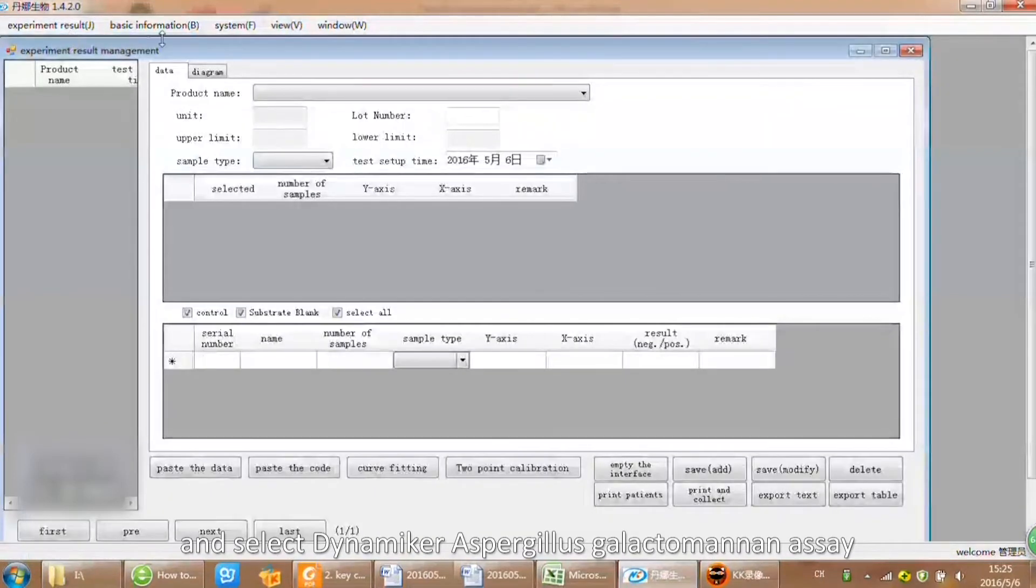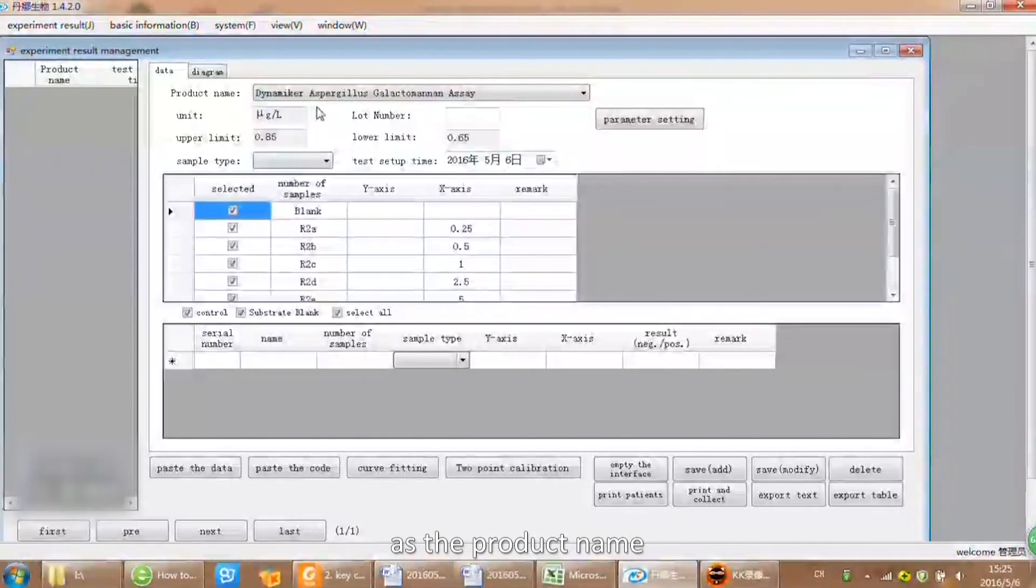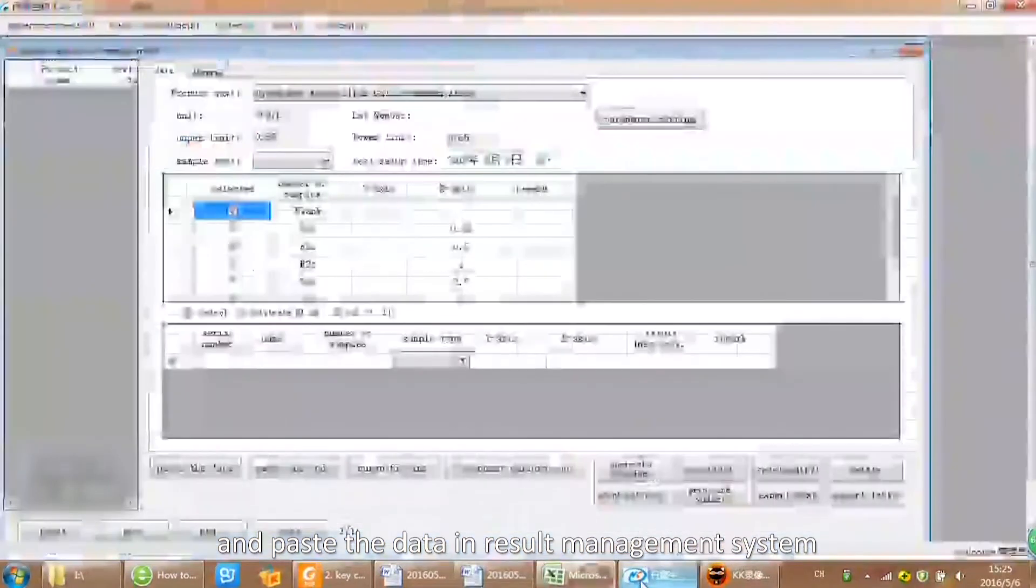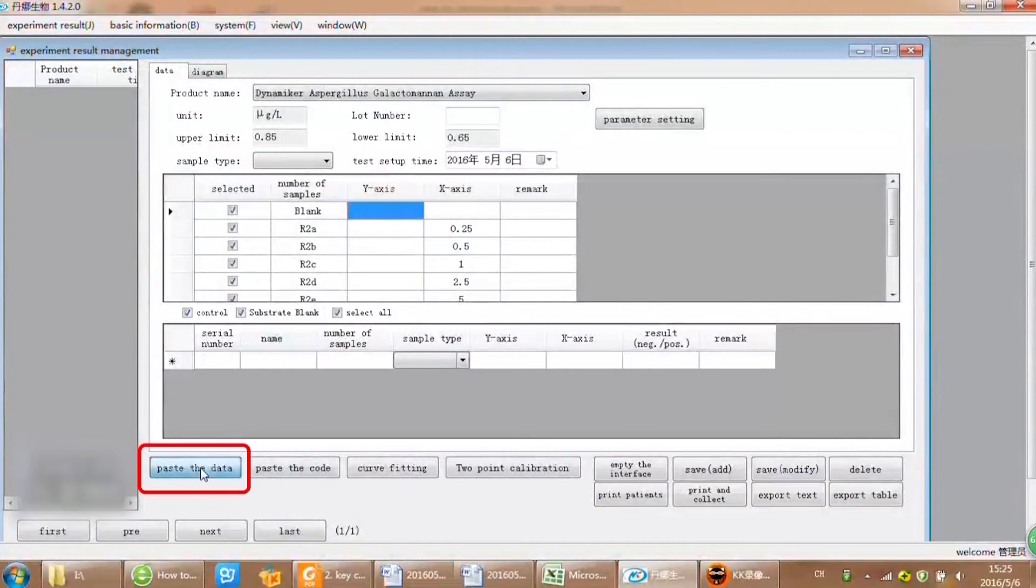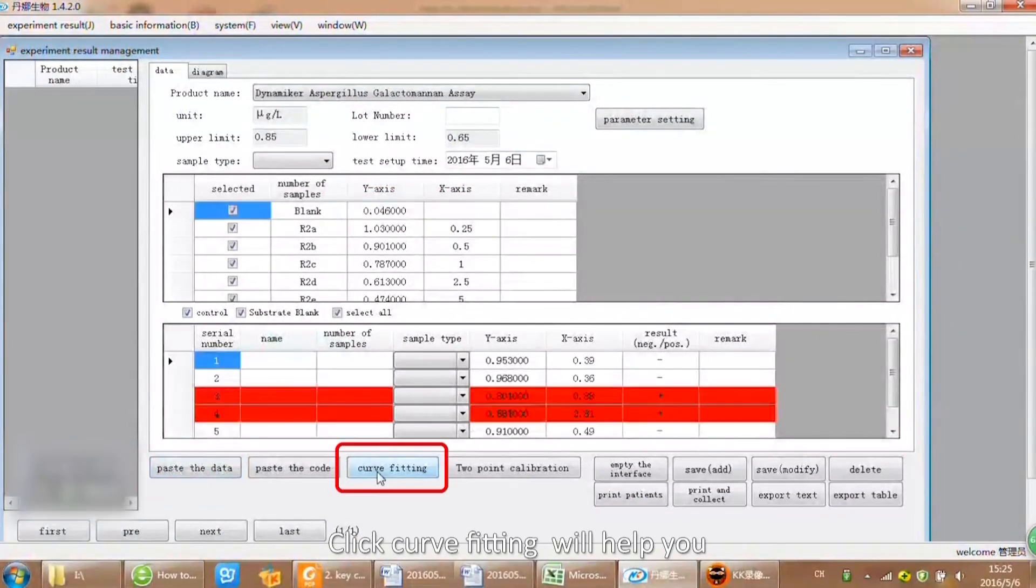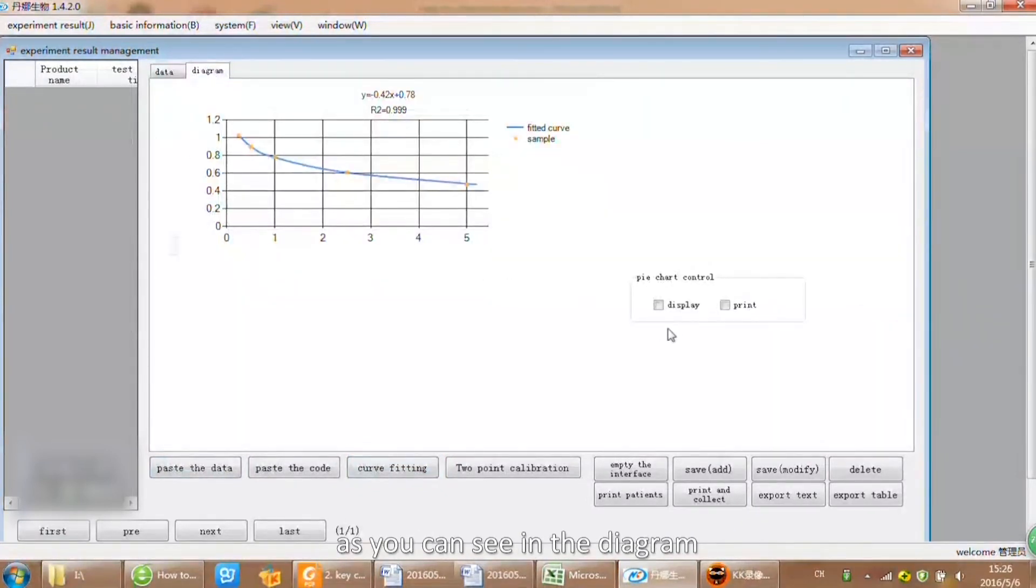Open the Dynamica experiment result management system and select the Dynamica Aspergillus Galactomannan assay as the product name. Copy the absorbance in Excel and paste the data in result management system. Click curve fitting will help you to construct the standard curve as you can see in the diagram.